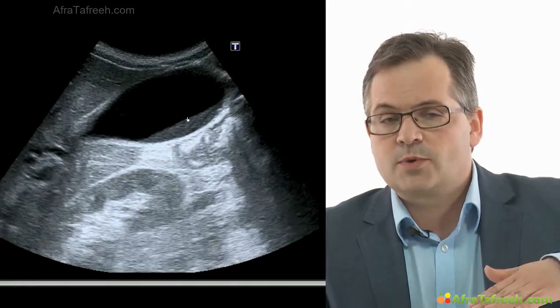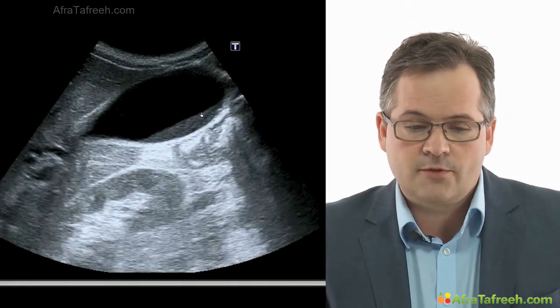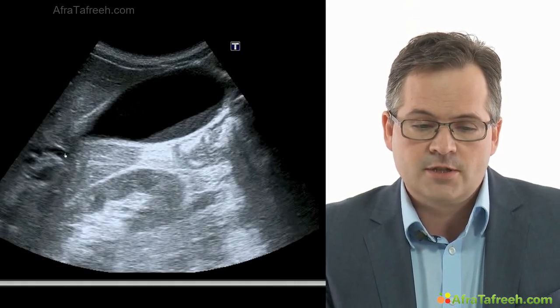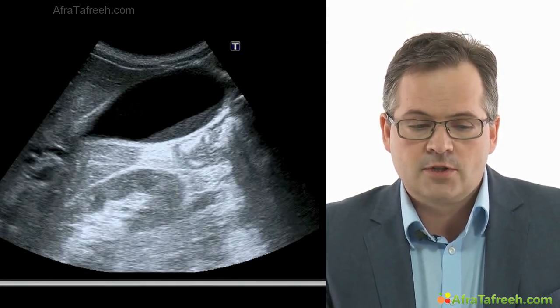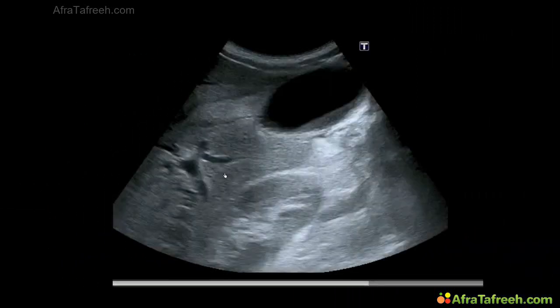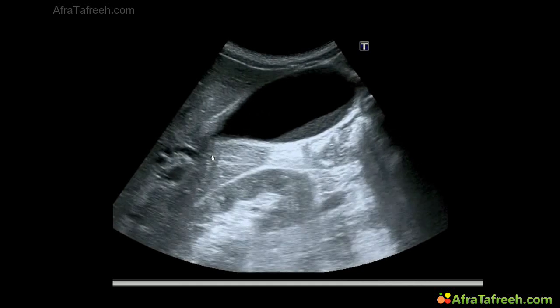Patient was lying in a supine position, so we have this horizontal border of the sludge in this region. And when we take a close look at the liver and the bile ducts, we see dilated bile ducts. But we're going to talk about this later on.